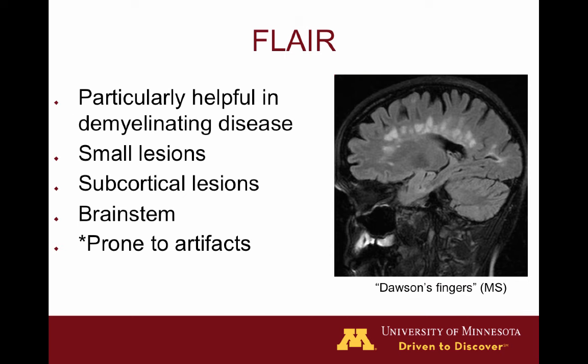This is an example of a turbo FLAIR image with fat saturation in the sagittal plane. You'll see some radiating bands of high signal coming out of the lateral ventricles, which is pretty pathognomonic for multiple sclerosis. These are called Dawson's fingers, and they have this particular orientation because they're surrounding veins — they have a perivenular location. FLAIR images are nice to detect small lesions, peripheral lesions in the subcortical white matter or cortex, and lesions in the brainstem, but there can be lots of artifacts with this sequence.